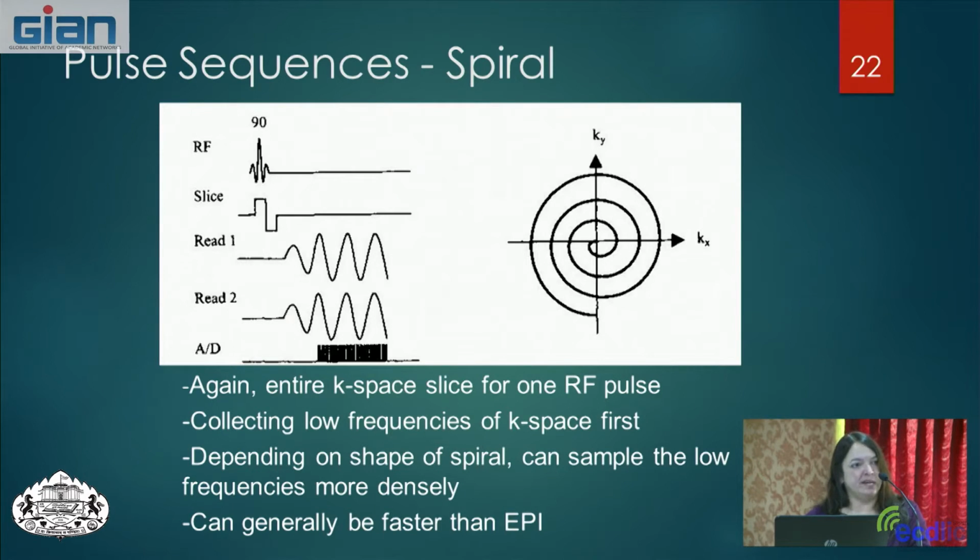And in the early days of fMRI, we had a physicist that designed this spiral sequence. So we used this often. But now we've bought a commercial scanner, and we use a lot more commercial technology than was available in the early days of fMRI. So this is the reason why most everybody has switched to EPI, because it's a commercially available sequence now and built into our scanners.